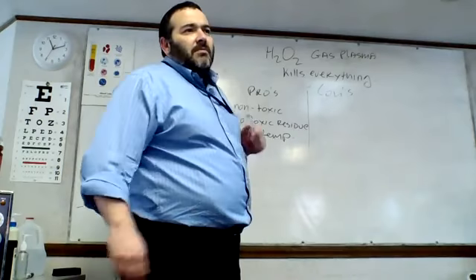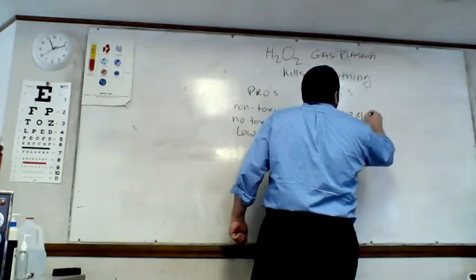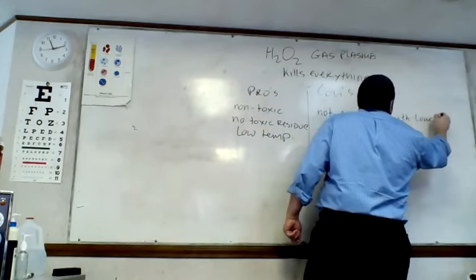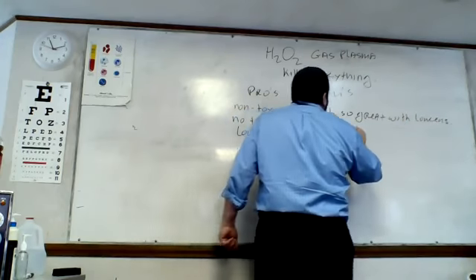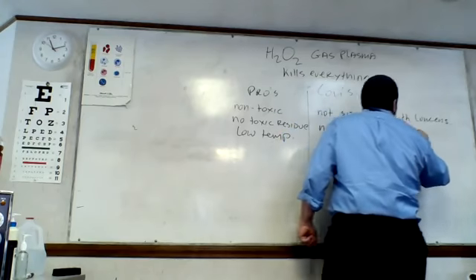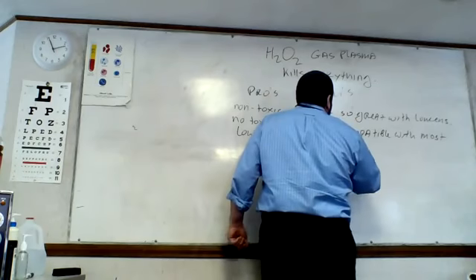Cons. You know what? Not so great with lumens. And not compatible with most packaging materials.